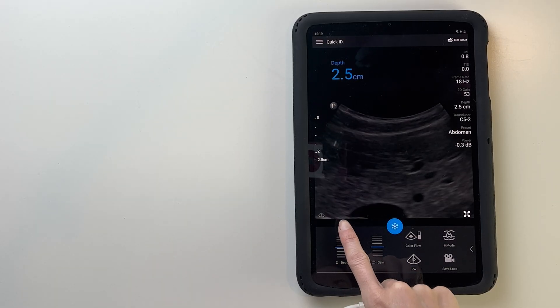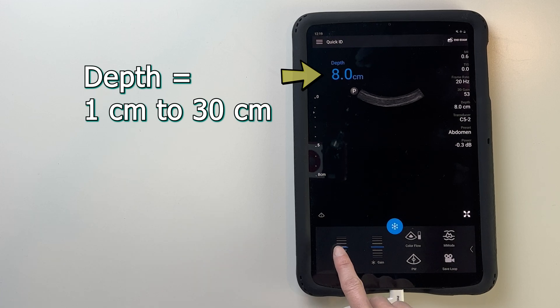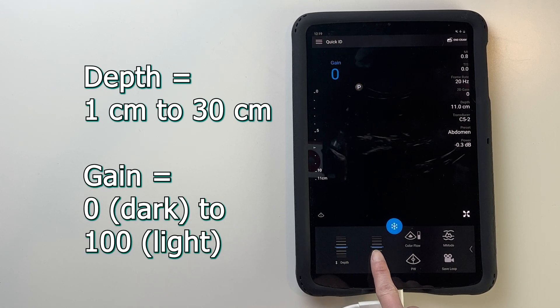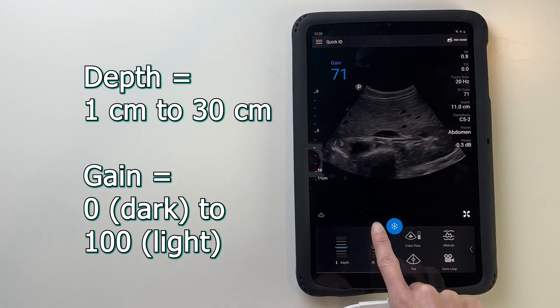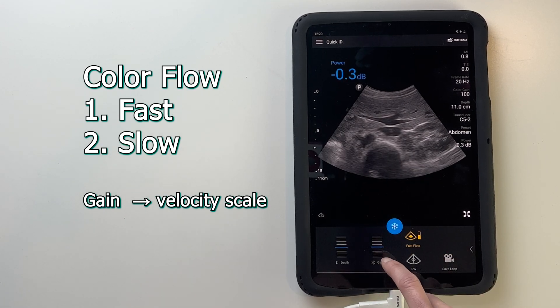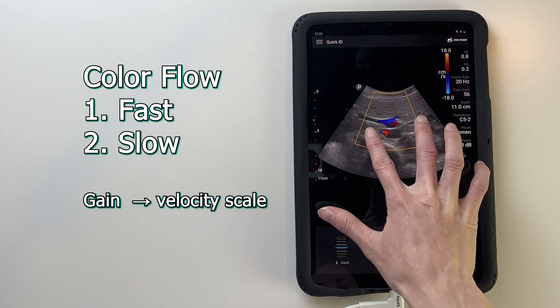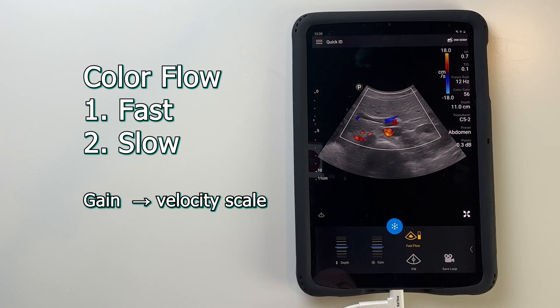The C5 can go as shallow as 1 cm and as deep as 30 cm. You can change the brightness of the image from 0 to 100 with the gain knob. The color flow has two settings — fast and slow — and you can move the color box with one finger and change the size of it with two fingers.